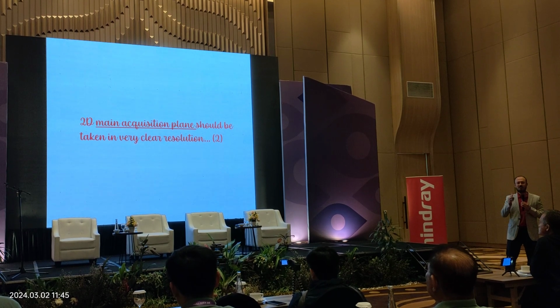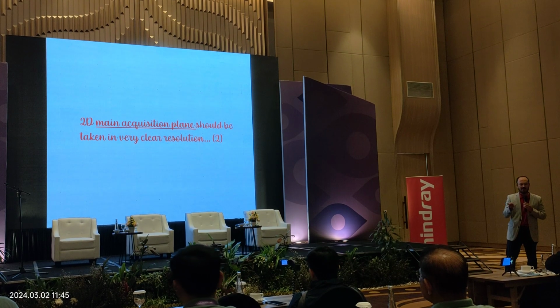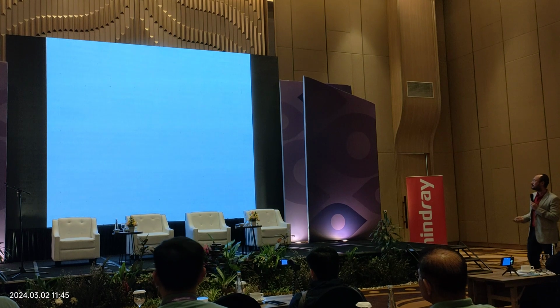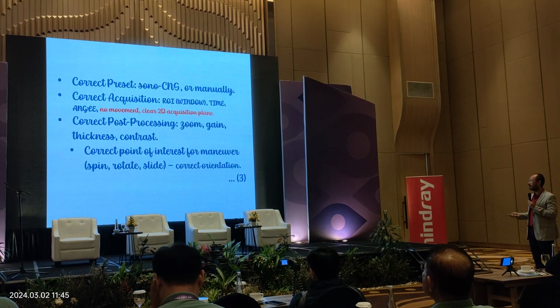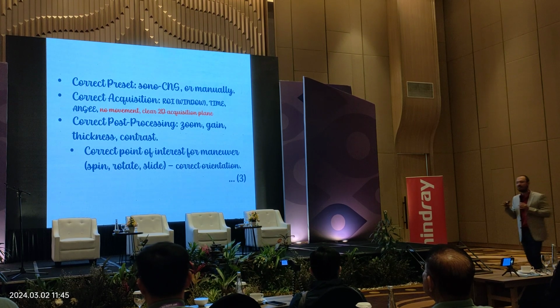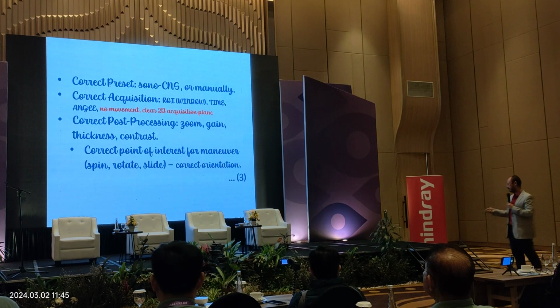If you want to do 3-dimensional, you cannot do good or great 3-dimensional if your plane in 2 dimensions for acquisition is not of good resolution. So you should do that the best. Correct the preset, CNS, or manually correct the acquisition, and so on. You have to do it by practicing a lot. Like Professor Leopold has told, it's like playing piano: your hands should be very familiar with the buttons. Okay.